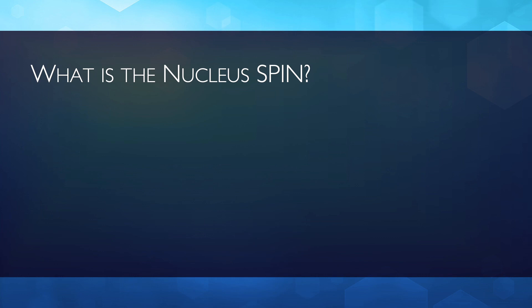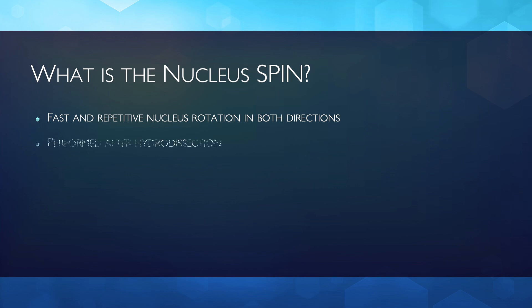What is the nucleus spin? It's a fast and repetitive nucleus rotation — hence the spin — in both clockwise and counter-clockwise direction. Performed after hydrodissection, its purpose is cortex release.